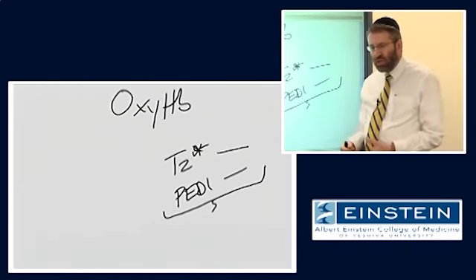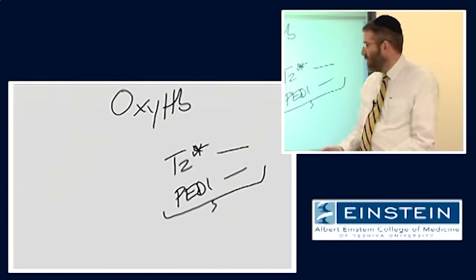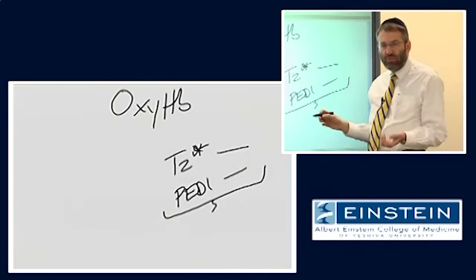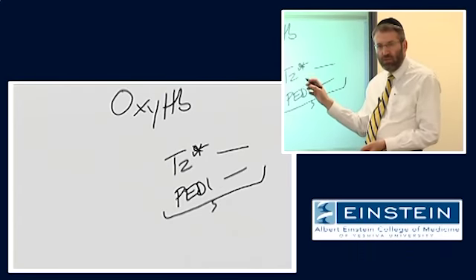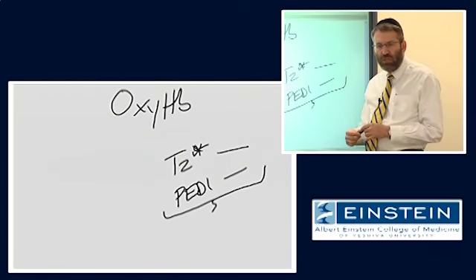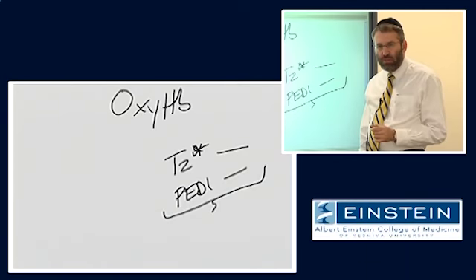Now, the tissue we're talking about here is a clot. It's a lump of blood, which includes both red blood cells, white blood cells, a few of them, and a lot of serum. The red blood cells, of course, contain hemoglobin, but they also contain other stuff as well. Whatever signal you see in the setting of oxygenated hemoglobin is a function of all the other stuff in the hematoma.